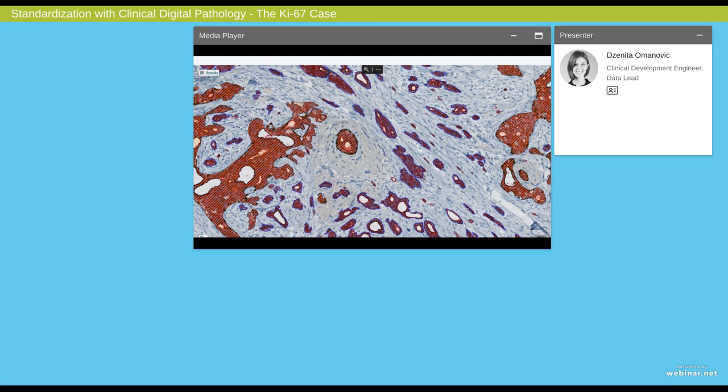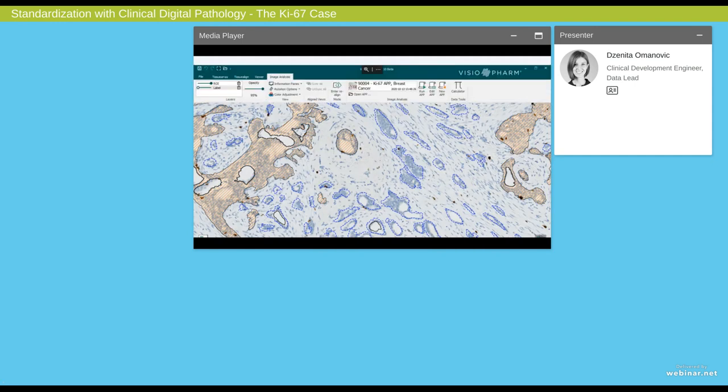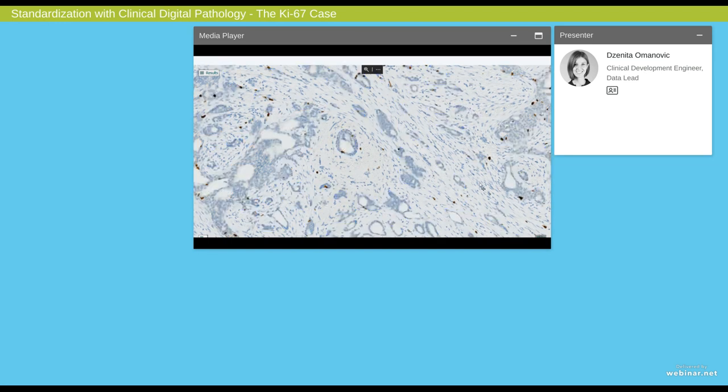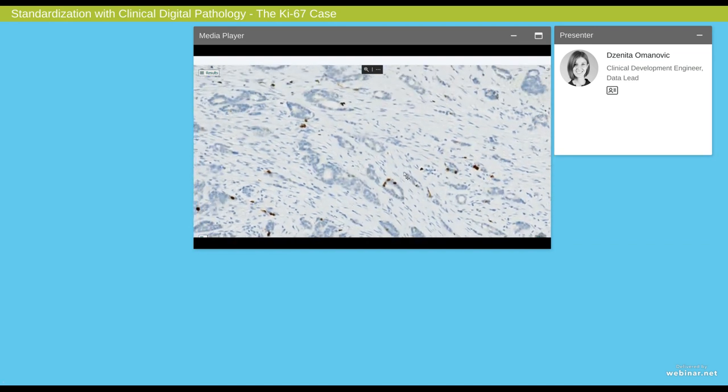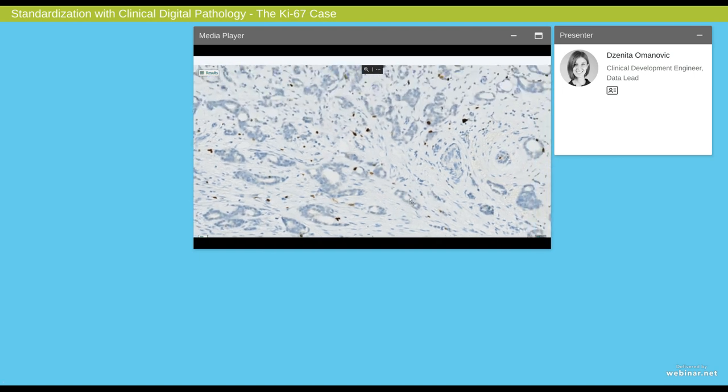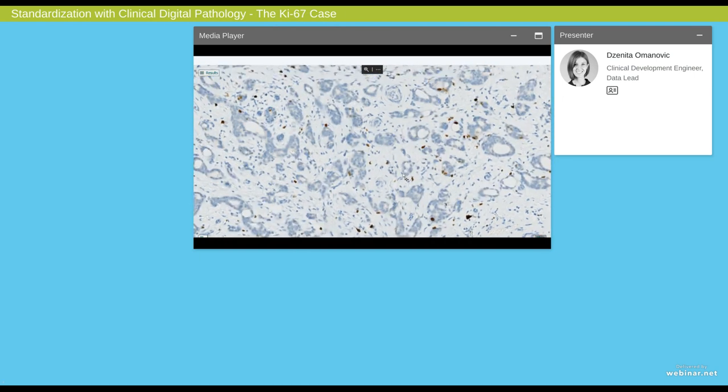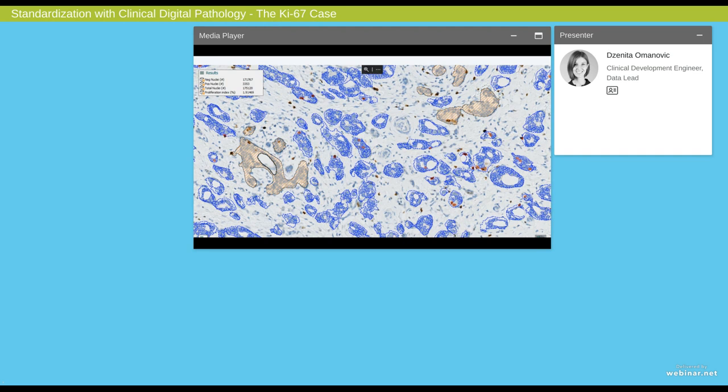We can then run our invasive tumor detection app on this image and we get the following result. Here we have outlined the invasive tumors in blue and the non-invasive ones in orange. Because this section is serial to our KI-67 section, we can easily transpose these regions onto our KI-67 slide. The next thing we then can do is that we can go in and assess how many KI-67 positive and negative nuclei we have present. For this we use our KI-67 app. Here you can see how our app very nicely outlines both the negative and the positive nuclei within the invasive tumor only. If we look at the results in the top left corner, we can see that on this tissue slide we actually analyzed a total of 175,120 nuclei. And I think that would have been very difficult to do manually, but this is something we can easily do with image analysis. We can also see that the proliferation index, the global proliferation index for this slide is 1.9%.